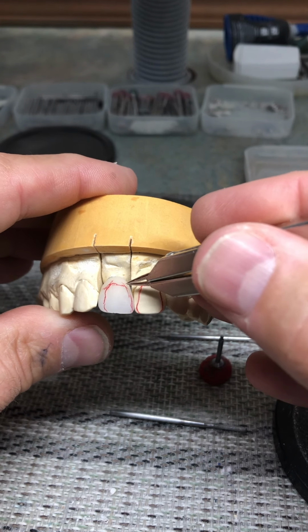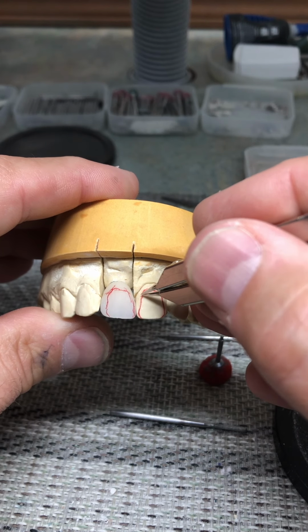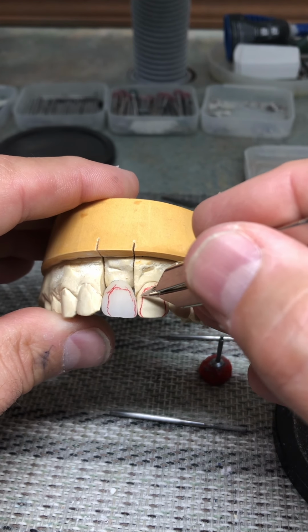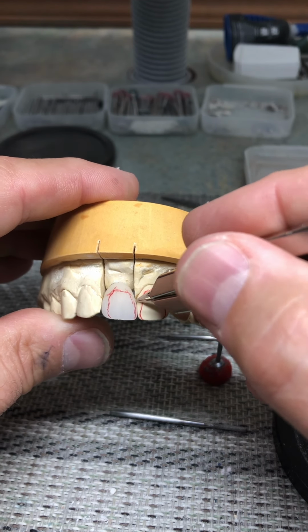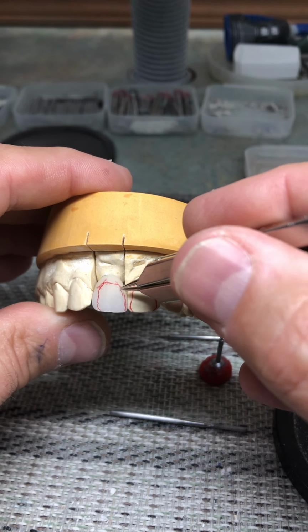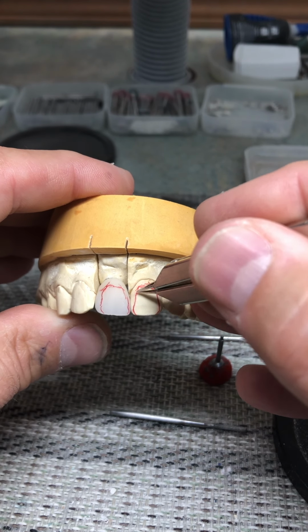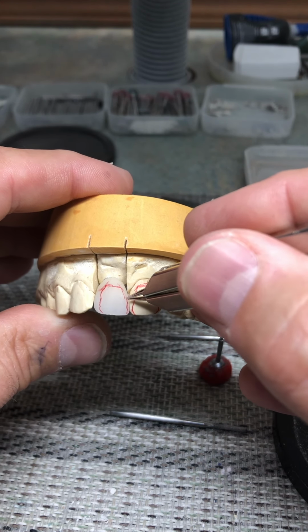this line angle compared to this line angle, and the way the surface of the tooth contours towards the contact zone. We can compare that to the crown, and obviously there's less contour here than there is on the tooth we're replicating, so this needs to be adjusted.